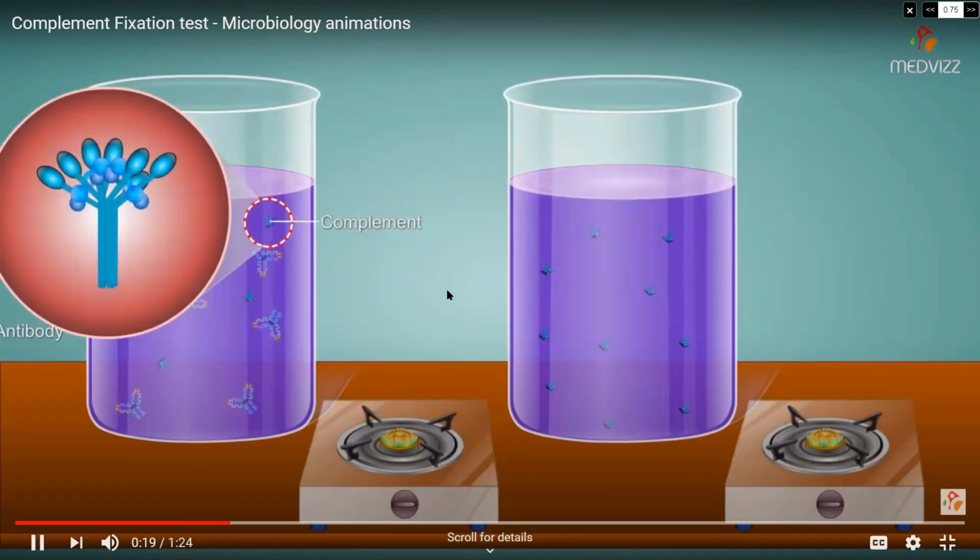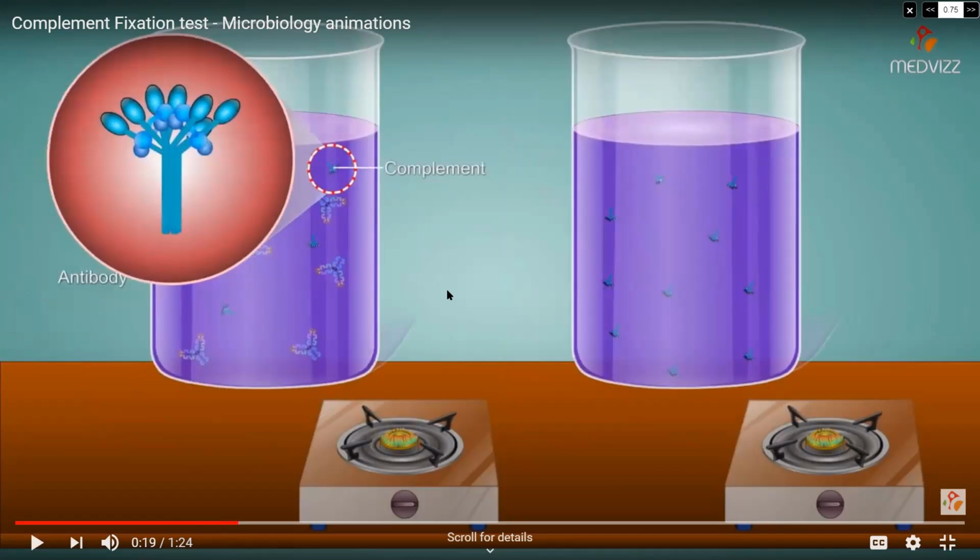So what you do is, अब आप standard complement जितना जिसका कितना fix हो रहा, okay, how much amount of complement protein or how well that complement protein is attaching to the antibody, you are trying to test that complement fixation test. You are trying to assess how well a complement protein is fixing to one particular antibody or the antibodies in the patient's body.